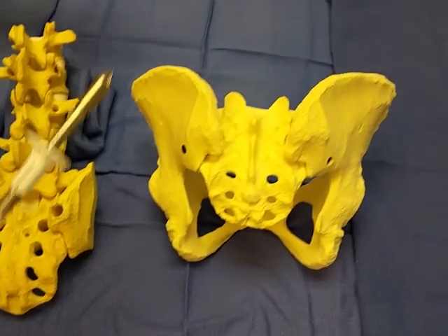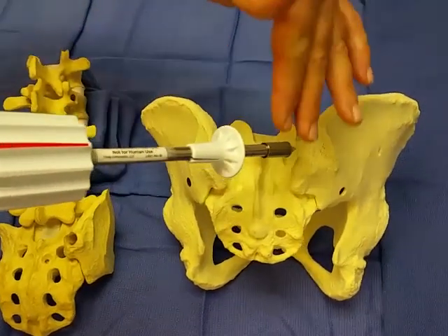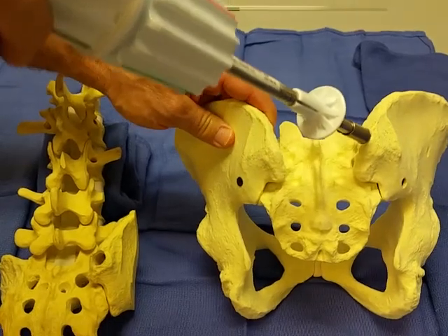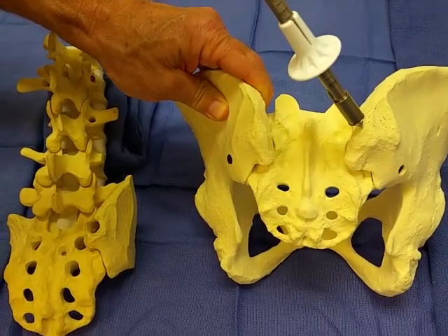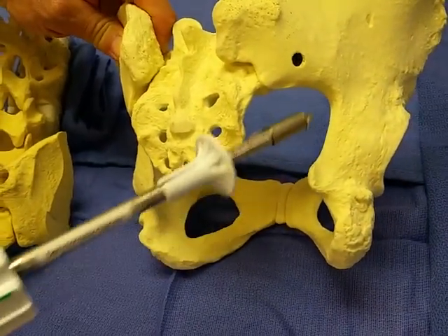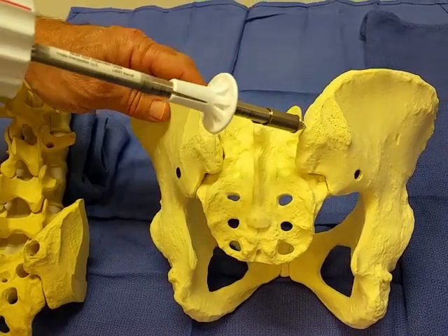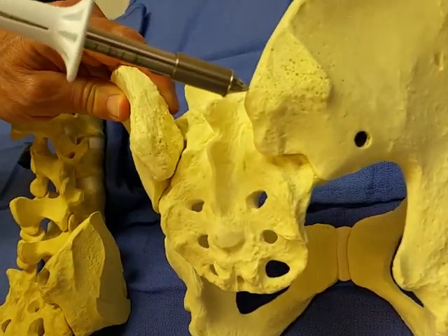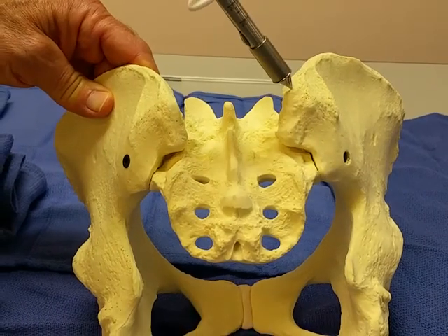The approach — the mid-sagittal plane is here. If we want to stay parallel to the plane generally defined by the inner and outer tables of the iliac crest, we have to angulate from posterior medial to anterolateral. We also can angulate a little bit caudal, staying out of the superior or greater sciatic notch, which is located right here. This would be a good entry angle — perhaps 25 to 30 degrees angulated from medial to lateral relative to a direct anterior to posterior angulation.